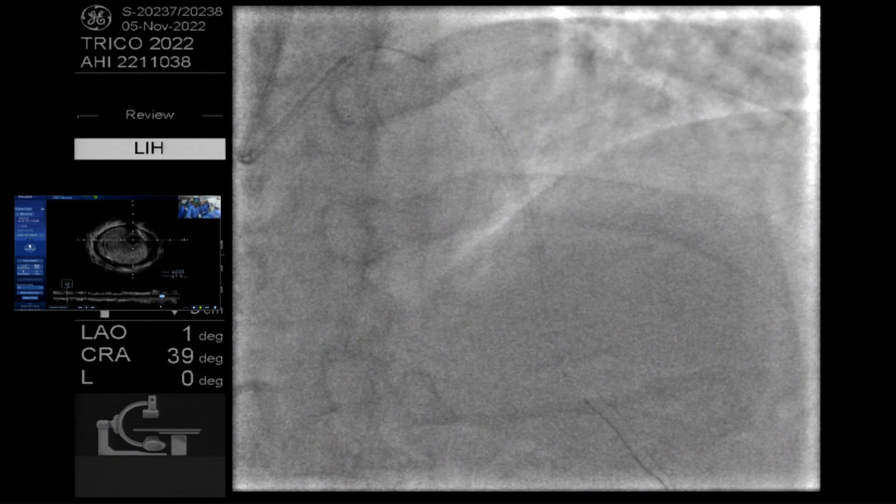How to measure? Asahi, medium to medium, right? Xion. Right. 4.8, right? Can you switch, yes, the reference to SAC? Okay.